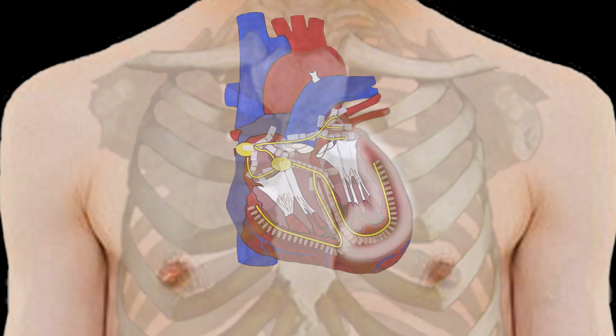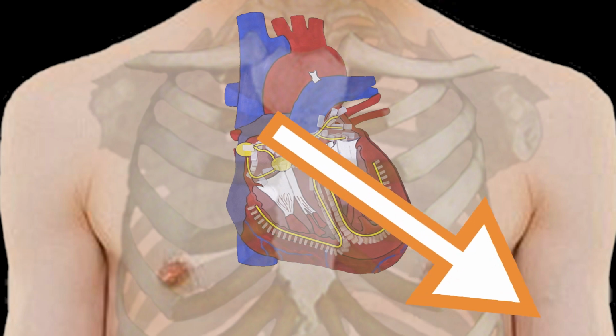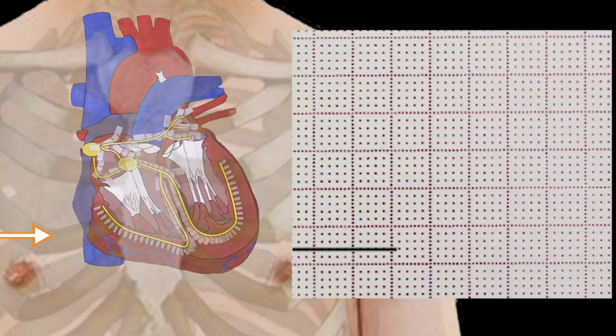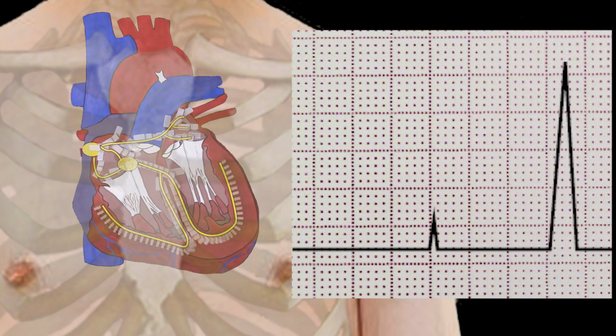For example, the thick, muscular left ventricle has lots of cells. When it depolarizes, it creates an electric field with a huge magnitude. The thinner right ventricle, on the other hand, has a lot less muscle mass, so it makes smaller depolarization waves. These depolarizations appear as deflections on our EKG. The bigger the vector, the bigger the deflection. Well, usually. Deflection size also depends on how directly a vector points towards an electrode. I'll show you what I mean.